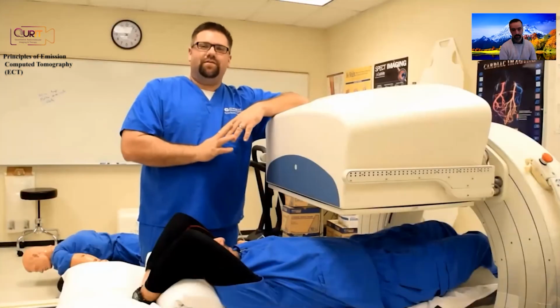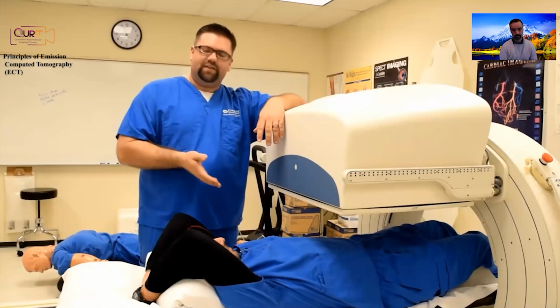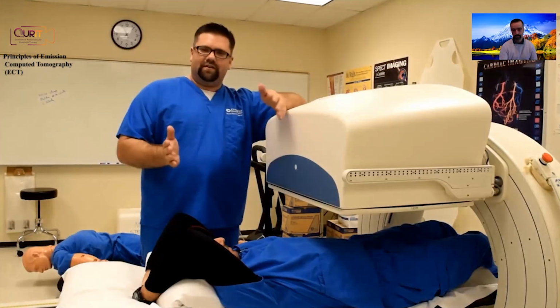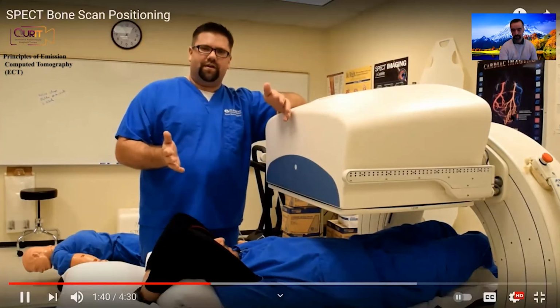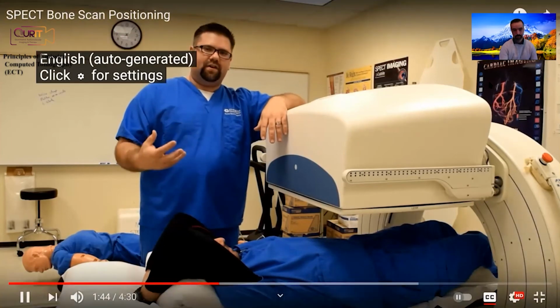So for a SPECT bone scan, you're going to bring the patient in and we're going to do the area of interest. In this case, we're imaging the lower spine and pelvic region. You'll take them in just so everything's in your field of view. It'll show up nice and bright on your bone scan because the radiotracer that we've given them has already had time to attach itself to the bone.